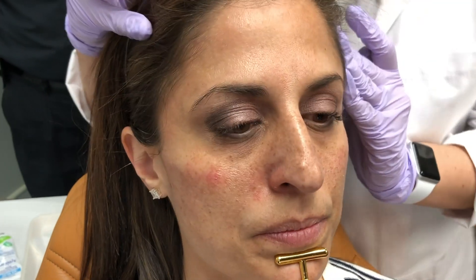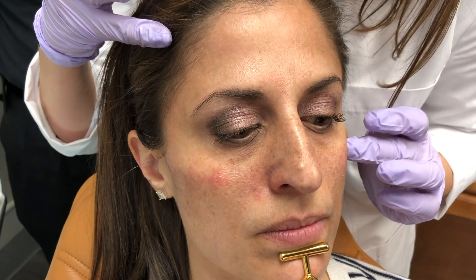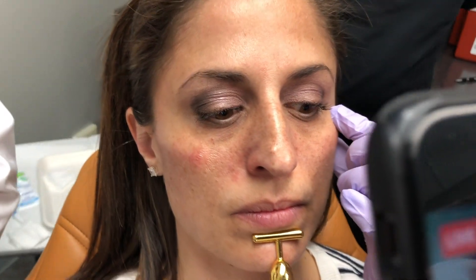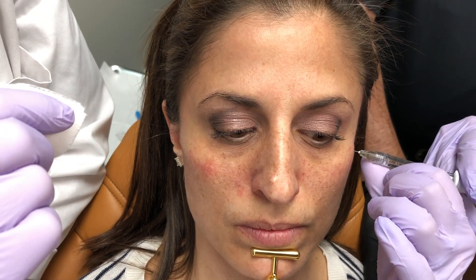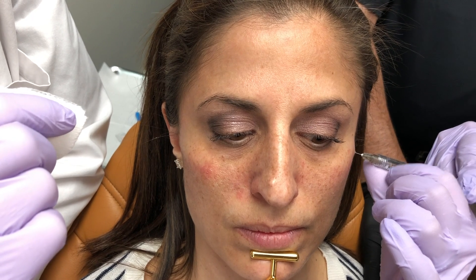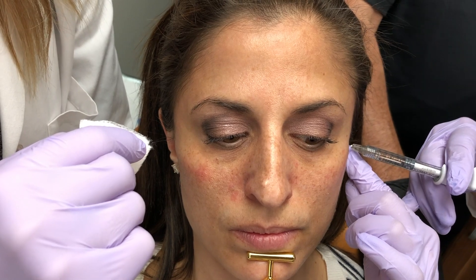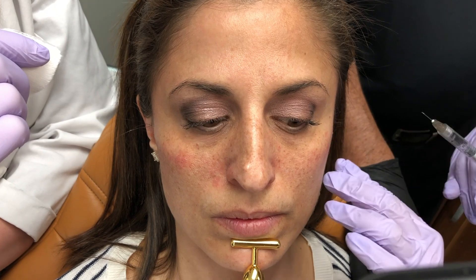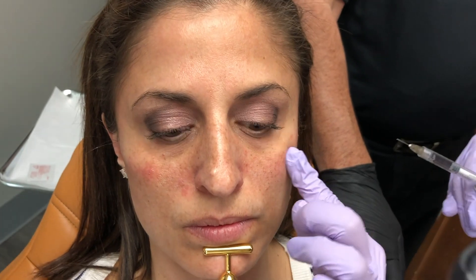Now Jill is going to assess this patient from every single angle — something we call the AAFE 360 injection technique. It's not just about looking from one angle; this is a three-dimensional cheek enhancement, and that's really what we're trying to deliver here. Voluma is a great product for delivering cheek enhancements because it gives you a lot of lift, it has a higher G-prime, and it's well proven.